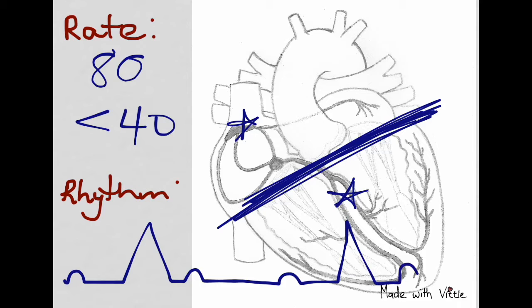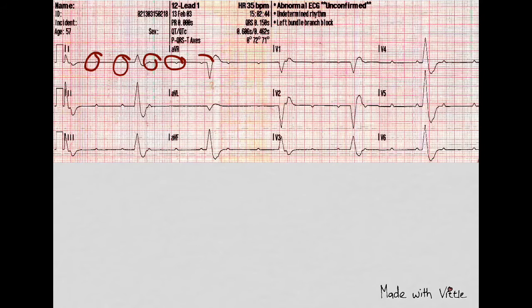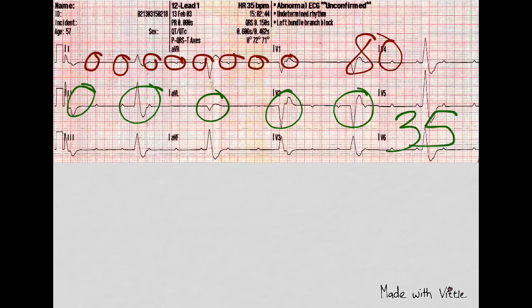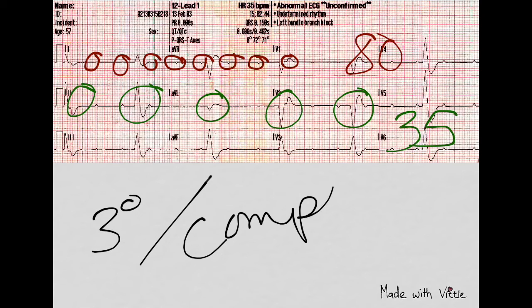The atrial rate will pan out at 80 and the ventricular rate will be much slower. We can see the P waves marching out across the tracing with an approximate rate of 80, and we can see the QRS complexes — wide and bizarre — marching out across the tracing with an approximate rate of 35. We can conclude that this is a third degree, or complete, heart block.